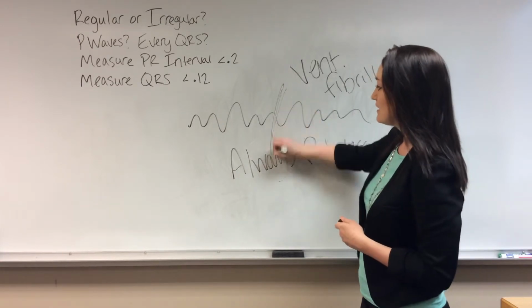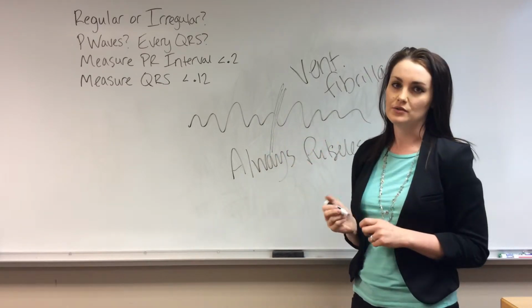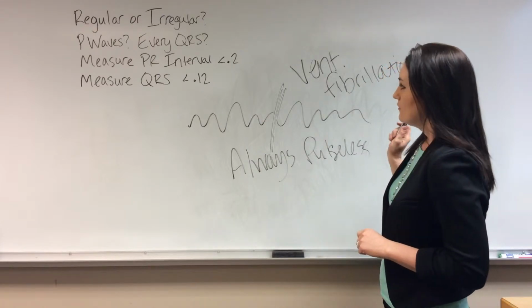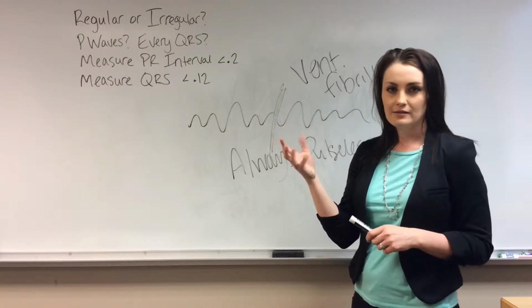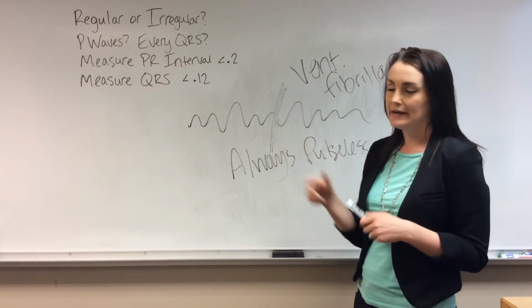So we can shock it and hopefully intercept that rhythm, kind of reboot the heart into what would be a more normal rhythm. So VFib, the heart is essentially just doing this. It's quivering. There's nothing happening. There's no contraction happening. It's quivering.